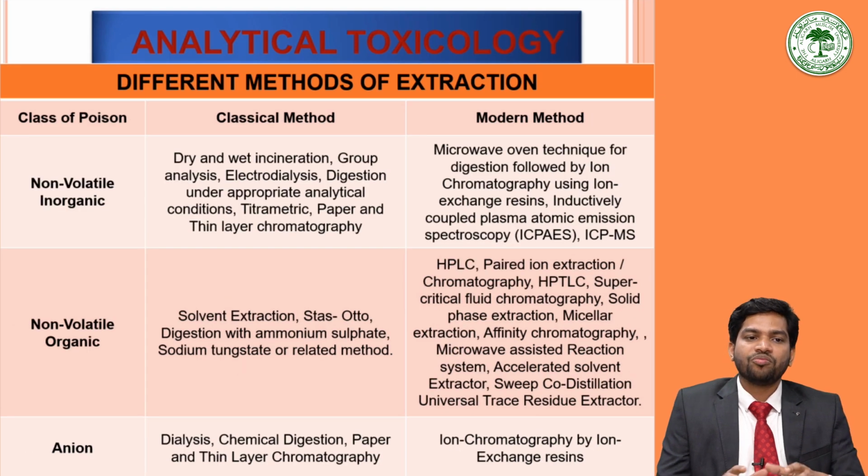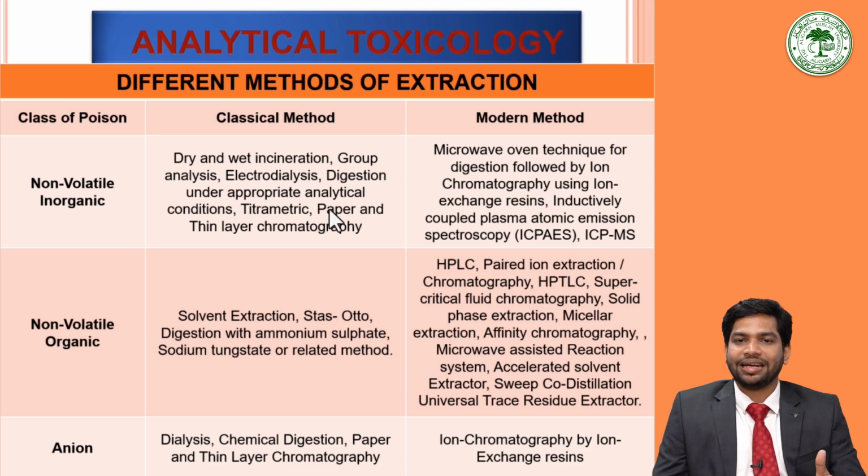Then for non-volatile inorganic compounds, the classical methods are dry and wet incineration, group analysis, electrodialysis, digestion under the appropriate analytical conditions, titrimetric methods, paper and thin layer chromatography.